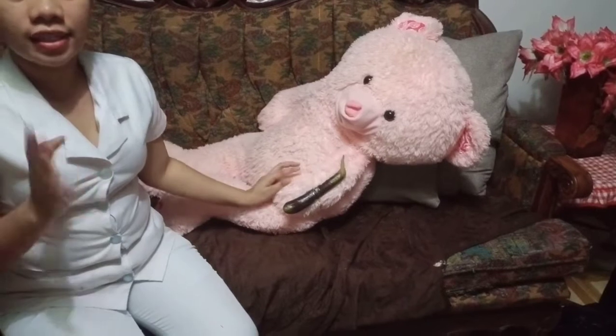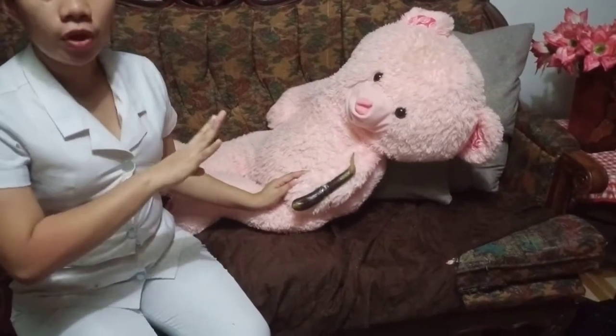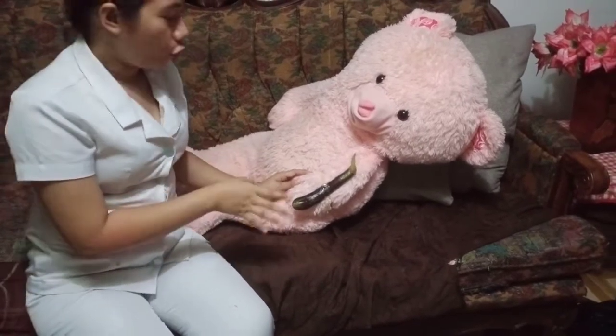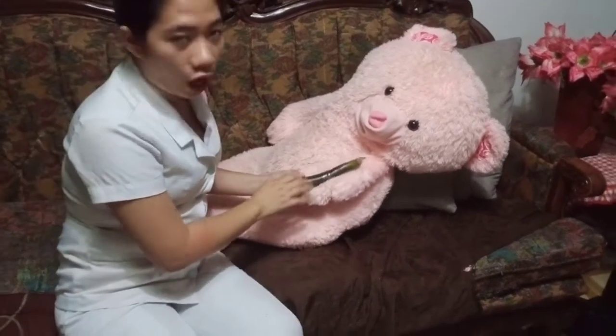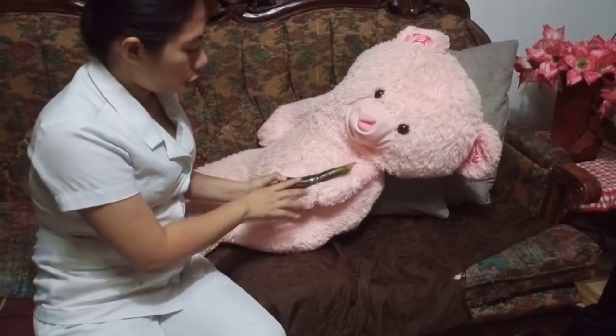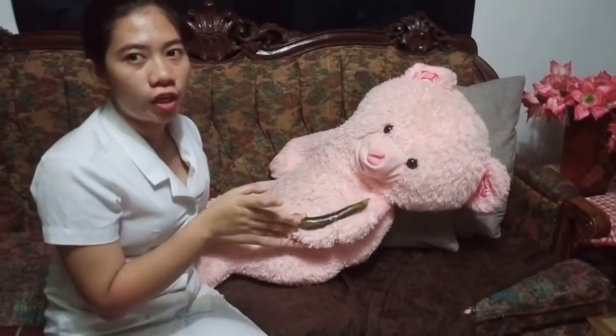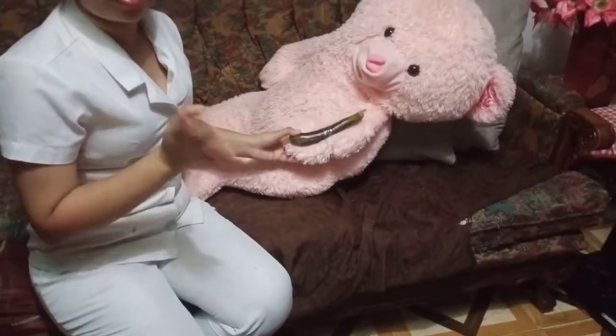Avoid using a site that is tender, inflamed, or swollen, or one that has a lesion. Since my client doesn't have a lesion, it's okay to inject here. If you see a lesion, you can choose another site to inject the medication.